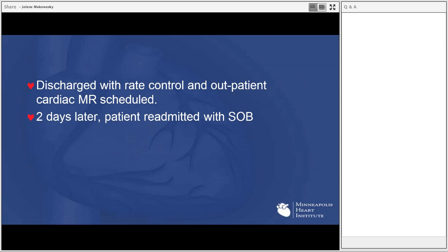If the wall is this way and you're trying to determine the wall thickness, you're talking about lateral resolution, and that's not as good. So you can overestimate or underestimate the wall thickness. So really, I think in echo, the best way to determine LVH will probably be from either the subcostal view or from a parasternal long axis view. And again, you're obviously limited by your resolution and so on.